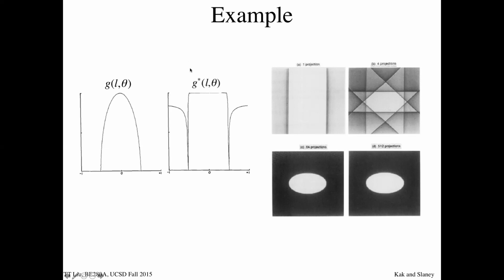A couple of features look promising. One is I have a flat top, which is good because my object is a disk. So I do want a flat top in my picture of a disk.